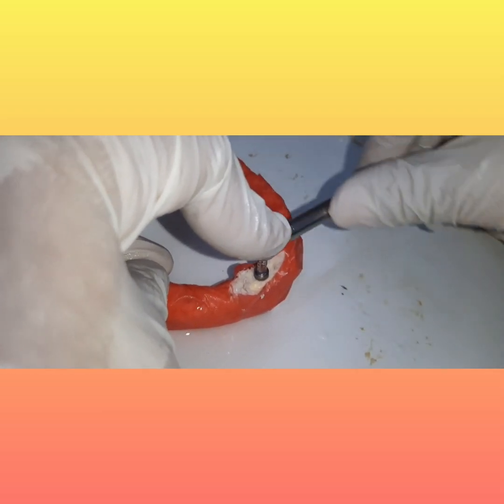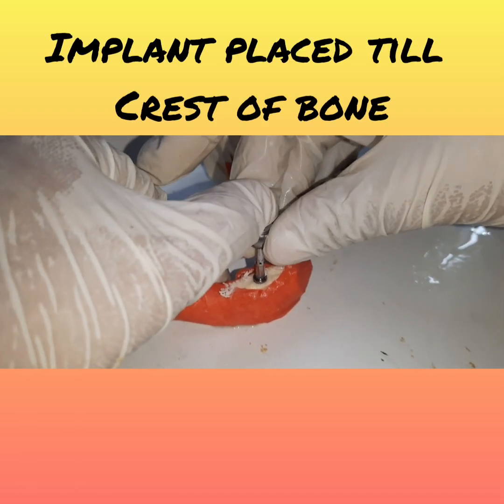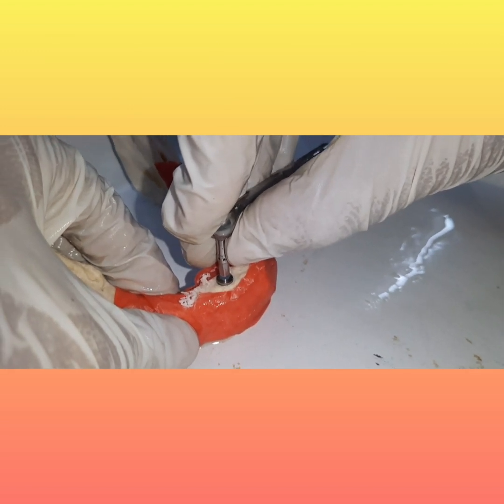Make sure that you're going clockwise only, not the other way around. So this will help in placement of the implant. So you'll be tightening this, and you'll be placing till you reach the level of the crest of the bone. So if you appreciate, we have reached the level of the crest of the bone.